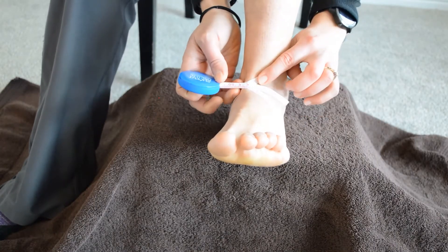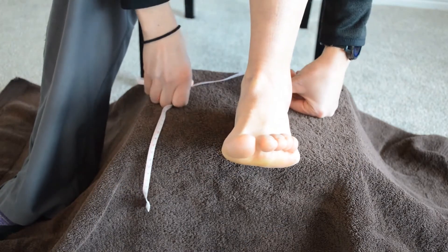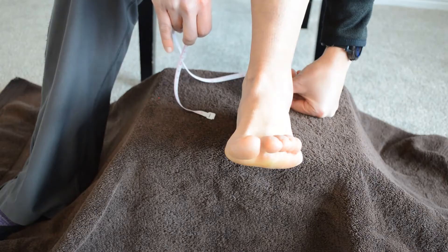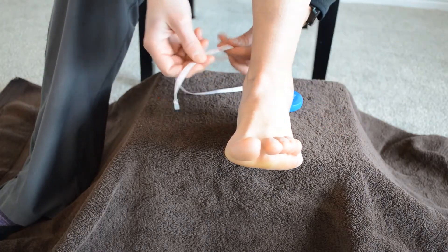Right there we're at 47 centimeters. You want to take measurements on both ankles so you can compare a normal ankle to the swelling in an ankle, because there is no typical measurement — it's just based on how much is normal for your body.